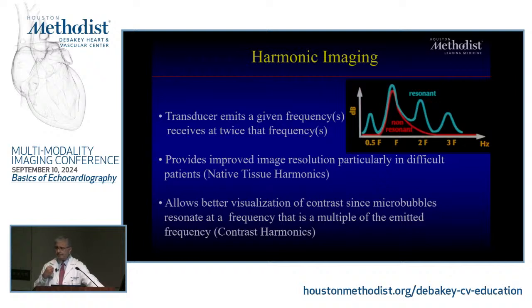Harmonic imaging, okay? What's harmonic? If you remember your physics, I'm not going to make it complicated for you, F is the fundamental frequency that you're emitting at. And if you emit it against a certain structure, that structure may resonate and give multiple, or even a sub, but usually a multiple of that frequency. 2 times F, 3 times F, they're usually lower intensity.